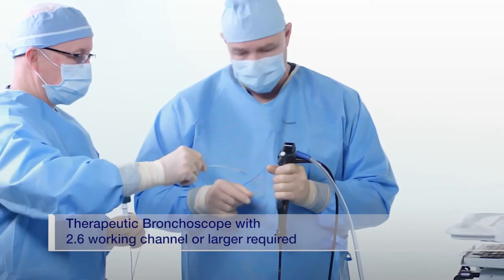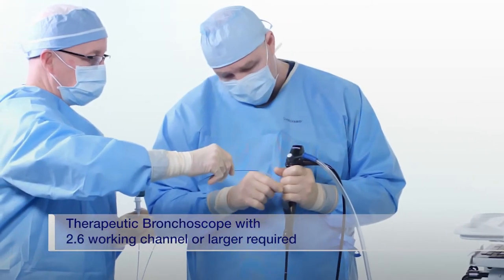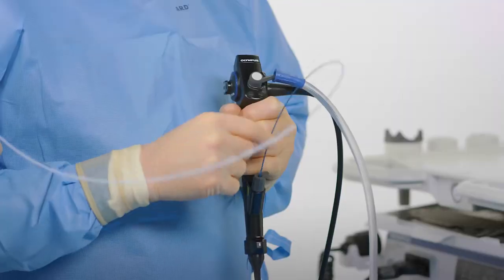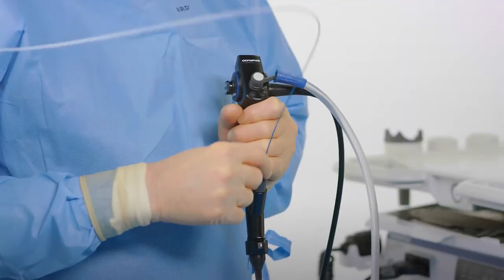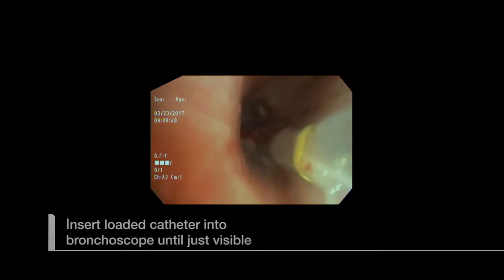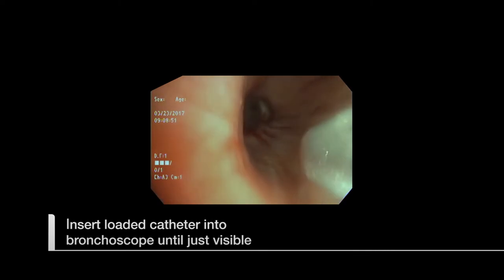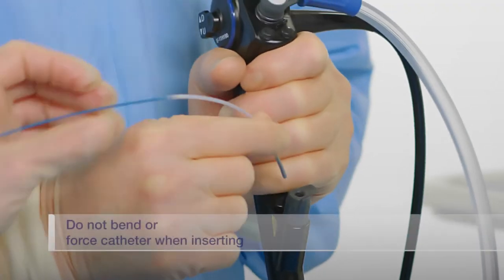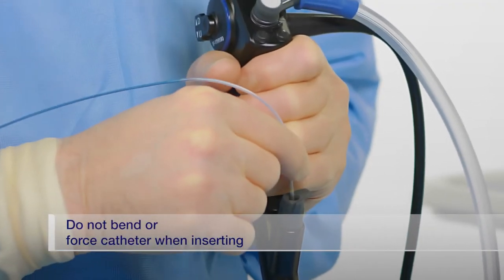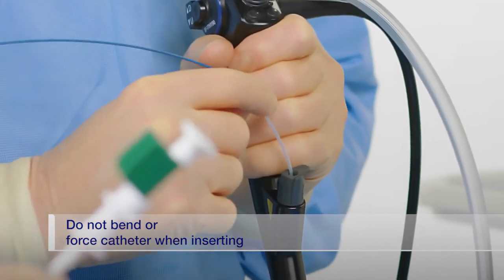While using a bronchoscope with a working channel of 2.6 or larger, carefully insert the loaded catheter into the instrument channel of the bronchoscope until the tip of the catheter is just visible. Do not bend or force the distal end of the catheter while inserting it into the bronchoscope.